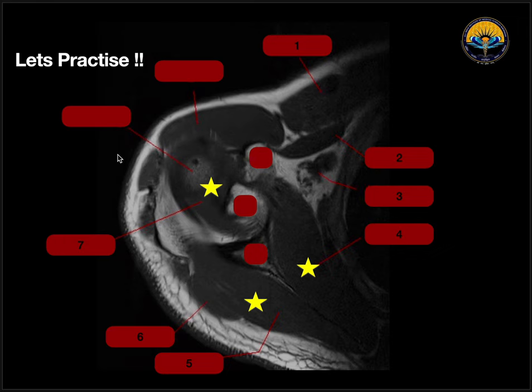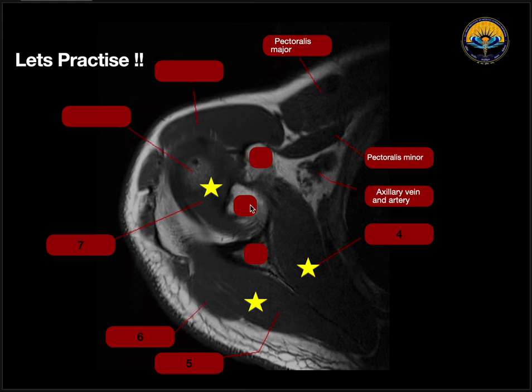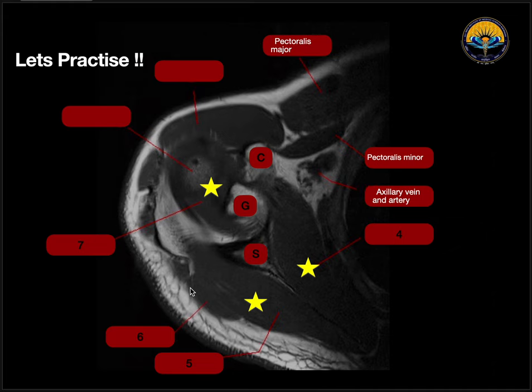Let's see the axial sections. On this axial section, the first anterior muscle we can see is pectoralis major. Just behind it, this small muscle will be pectoralis minor. This will be the axillary artery and vein. We can see the humeral head, and above the humeral head, we can see the insertion of supraspinatus. This will be the scapula, and due to the scapula, we can see the subscapularis muscle, the infraspinatus muscle, the supraspinatus muscle, and the deltoid muscle.